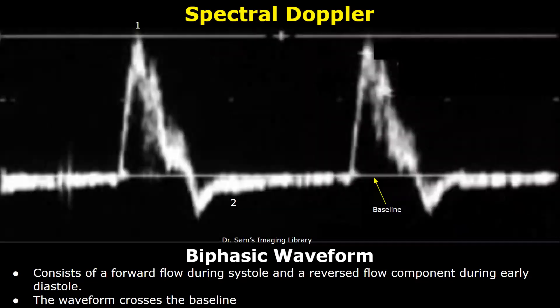This is another biphasic waveform. We see a large forward flow component and we also see a reverse flow component, so two components are present, therefore it is a biphasic waveform, and this waveform has crossed the baseline.